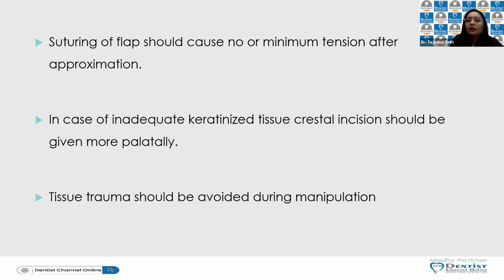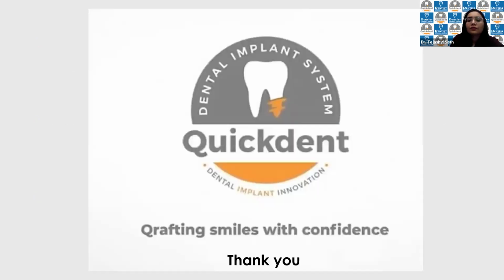And in case where there is inadequate keratinized tissue, the crestal incision should be given more palatally, more lingually, and avoid tissue trauma. Asepsis and tissue trauma, that is actually in your hands, that can be taken care of.